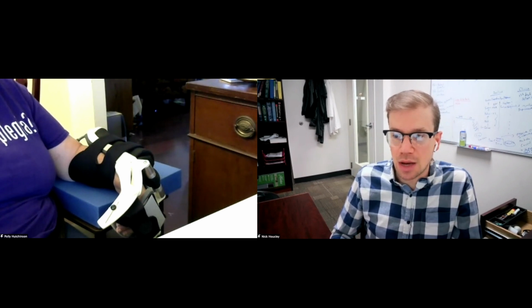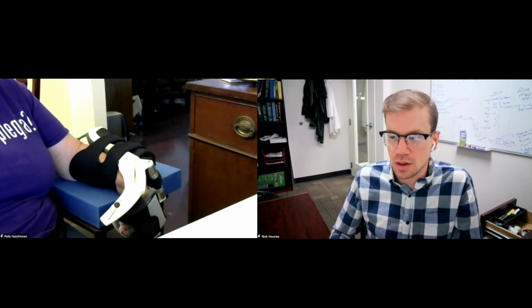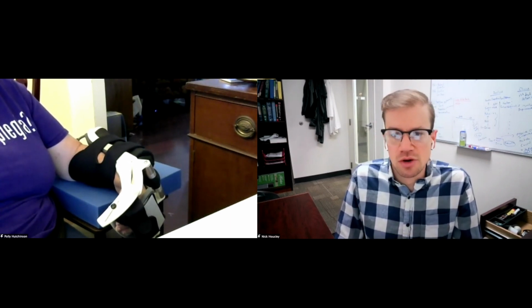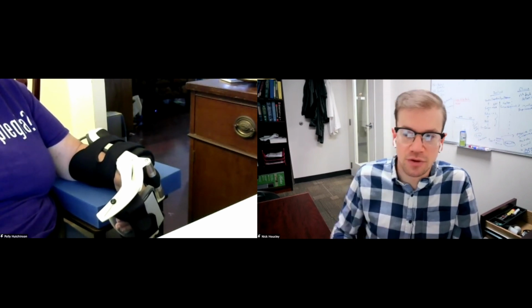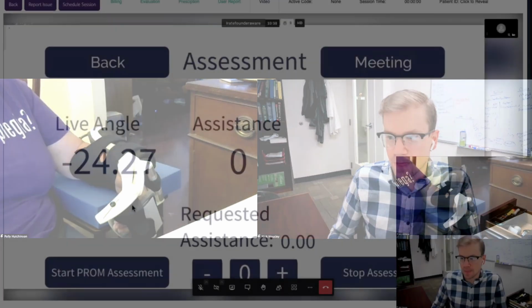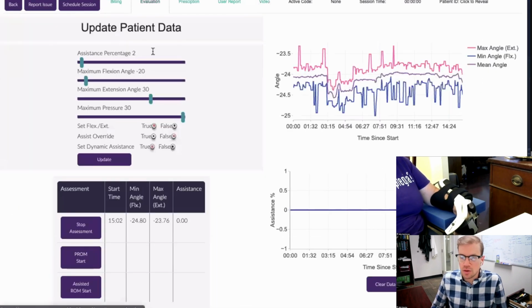So what we'll do is I would like you to go ahead and try to move as much as you can into extension. Go as much as you can. Great. One thing I'm also going to remind you, so just pause there for a second. Since you have it on your left side, you may have heard me talk about mirroring activities. So let's use your right hand. Right hand and left hand simultaneously, I'm going to have you move them into extension. So let's have you go up with both hands as far as you can. Great. And then I'm going to have you go down as far as you can into flexion. Okay. Some trace movements there. That's okay. Very good. Does it make sense why I'm asking you to use both hands there? Yes, I do that quite a bit.